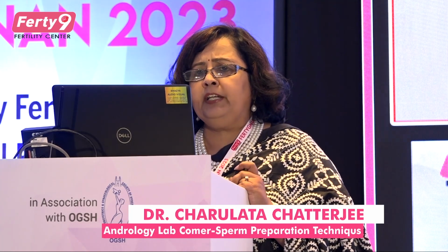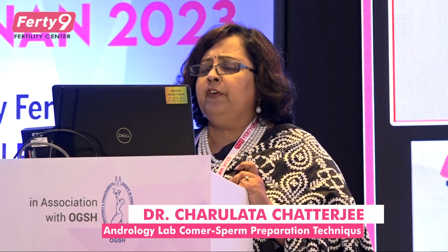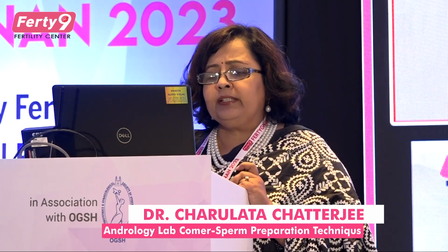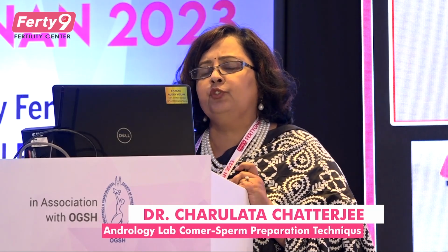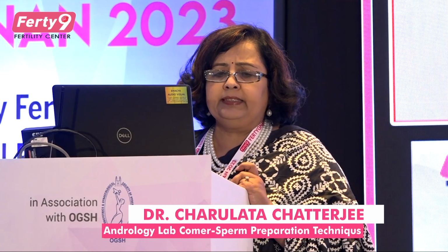Now in case of retrograde ejaculation, if a patient comes with retrograde ejaculation, first we have to do urine alkalinization, then urine centrifugation, and that sample is used for ART. So even this sample can be used for ICSI.